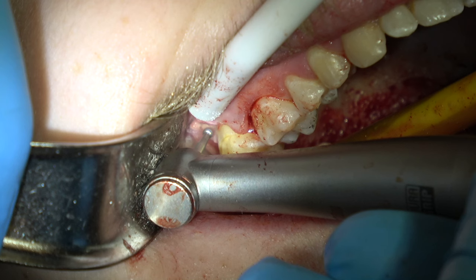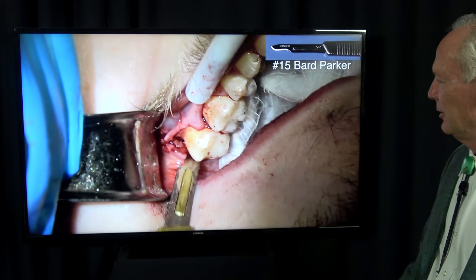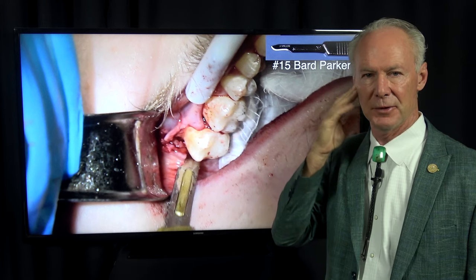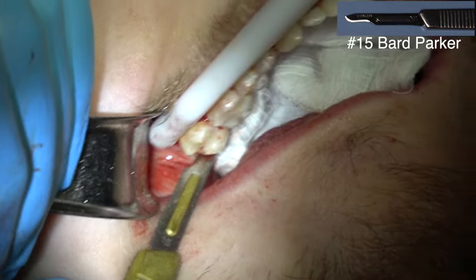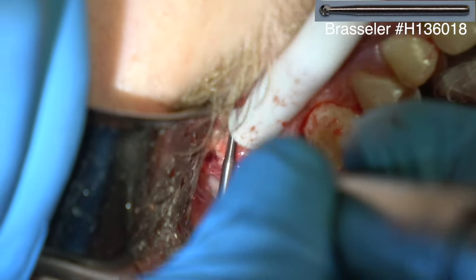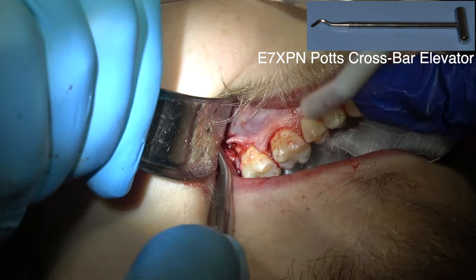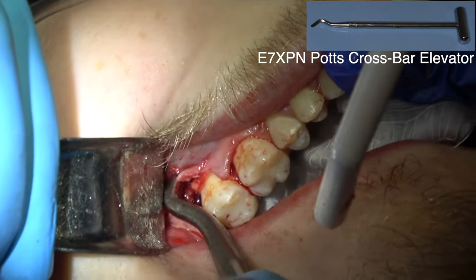Being really careful not to touch the second molar — anything I'm cutting, I'm cutting into the third molar. Here's another hot tip: whenever you're working back here on either side, I like to use a bite block. You don't want a tall bite block or the patient's open so wide you can't get to it — you want either no bite block or just a small one. You don't want a wide bite block on the opposite side from where you're working. I'm trying to remove some tooth structure to gain access and elevate the tooth. Going back with the POTS elevator — it's just a tight squeeze. Having a fabulous assistant is just invaluable in these situations.